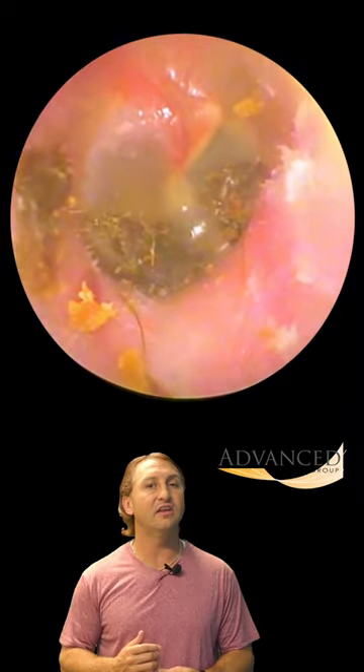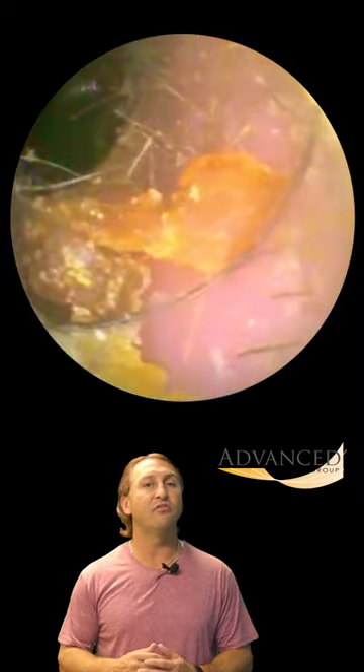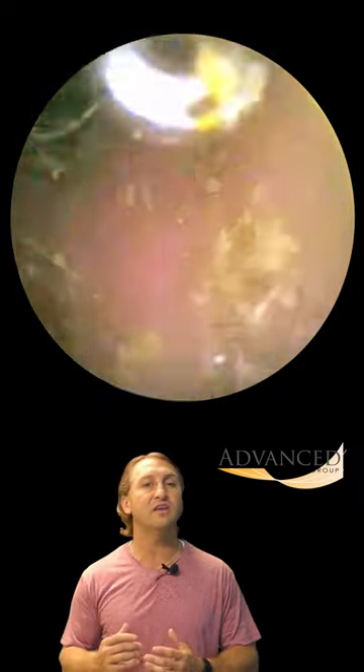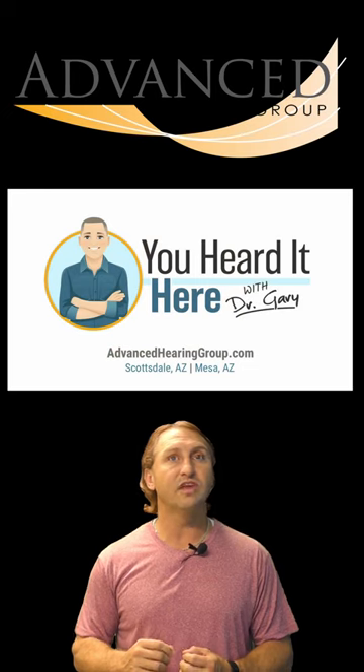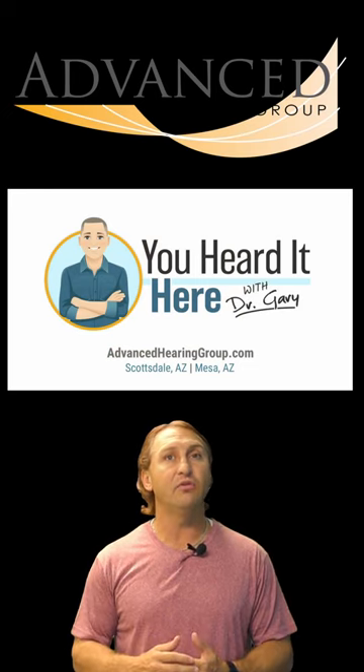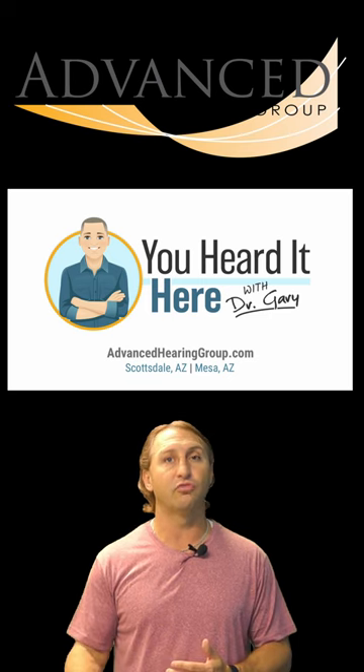You can see them down there again. So now we're going to go to the irrigation. Once we get this off the ear canal floor, we're still using that angled curette because it's just making it easier given the patient's ear canal shape. Unfortunately, my camera light died when I was doing the irrigation, so we don't have a great view of the eardrum, but we did get everything out. We reviewed the video and it looked great.